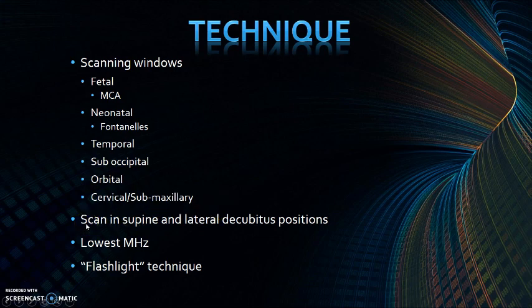We scan the patient in supine when we're doing the temporal bones. Once we're scanning through the back for the basilar artery and vertebral artery, you can either have the patient turn their head sideways or turn their whole body lateral, the decubitus. And we use the lowest megahertz possible in order to get a good Doppler flow. And we use a flashlight technique, or I like to say a joystick technique, because the face of the transducer pretty much stays in the same spot, kind of like on a neonatal brain, and you just angle your transducer left and right in order to get the windows.